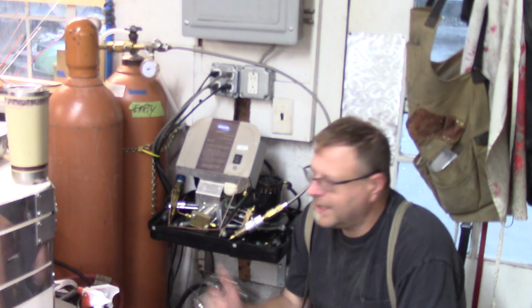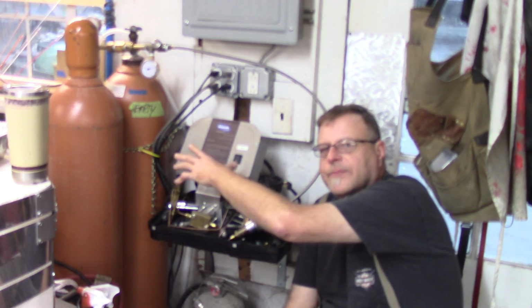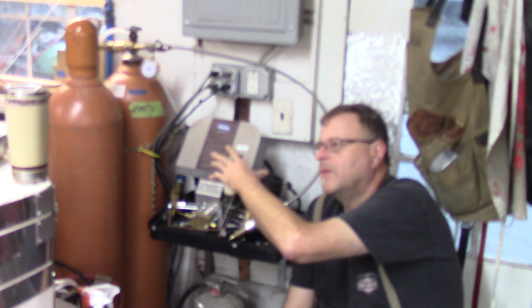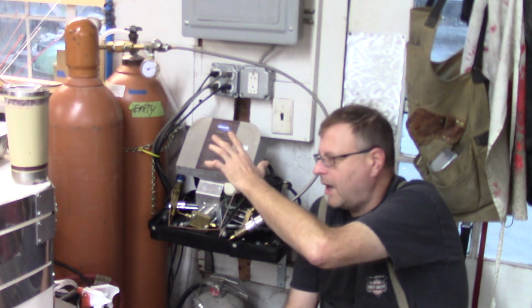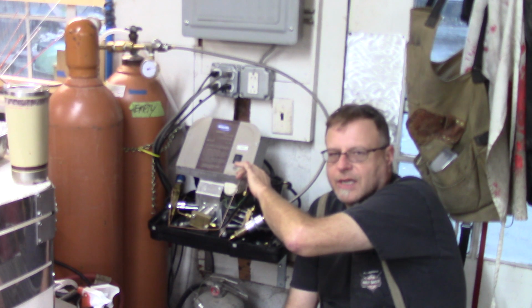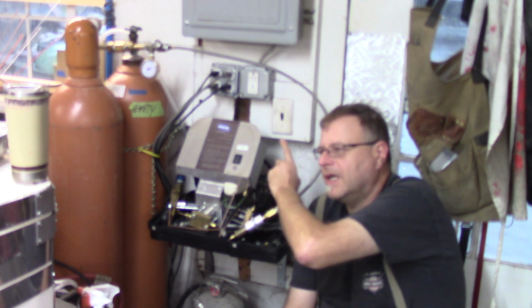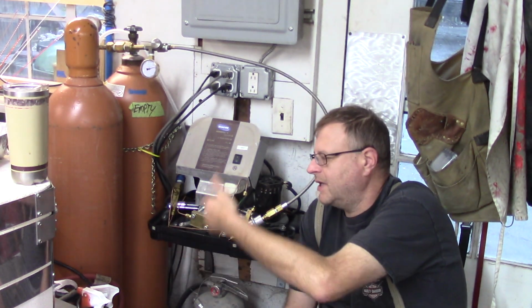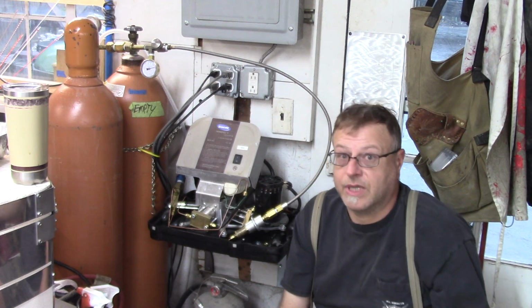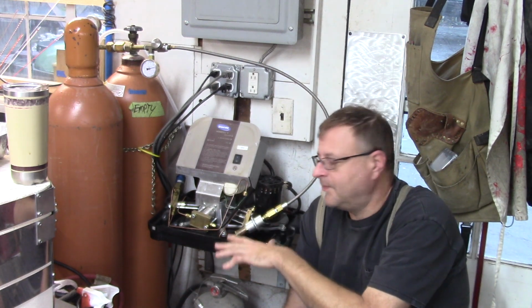So what is this thing? I'm going to set aside the electronic wizardry that's inside of this because I don't want to say it's simple, but it is relatively simple. Inside of this thing is an oxygen sensor that detects purity of the oxygen. And when it detects the proper purity of the oxygen to compress the oxygen, it turns the compressor on. What's the compressor? The compressor is a 5-cylinder radial engine.